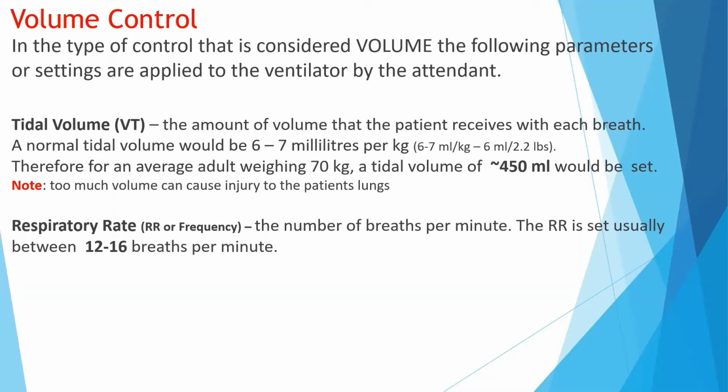Another setting, very important, is the respiratory rate, sometimes referred to as frequency or RR. This is the number of breaths per minute. The respiratory rate is set usually between 12 and 16 breaths per minute.